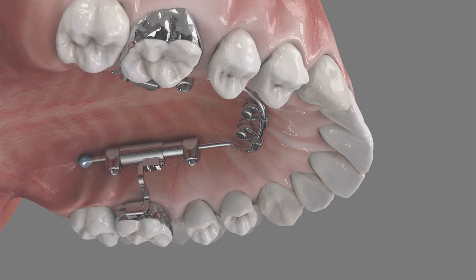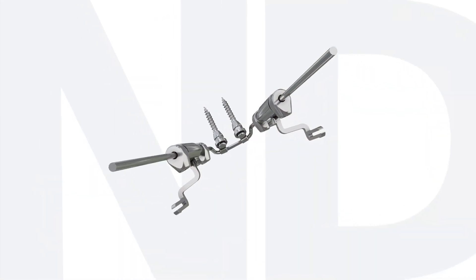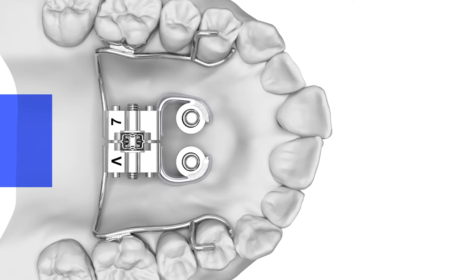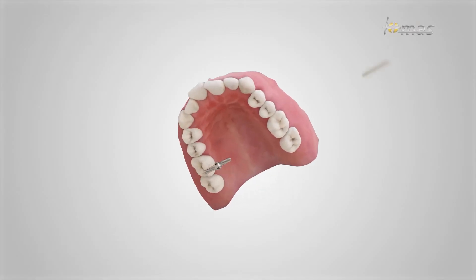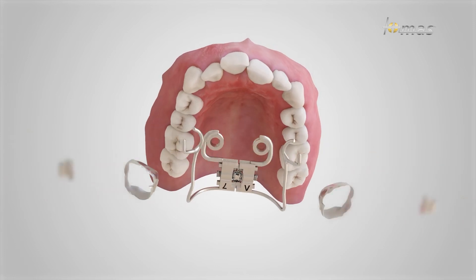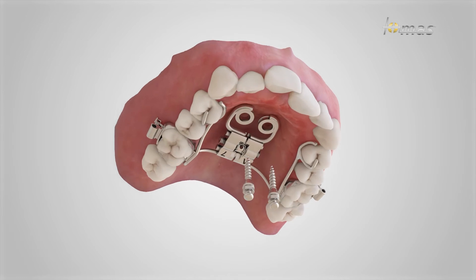With the help of the new Thomas RPE islet, skeletally anchored RPE appliances can be manufactured according to the pin last concept. Fitting the RPE appliance and the mini implant is possible in one appointment. An additional insertion template is not required.